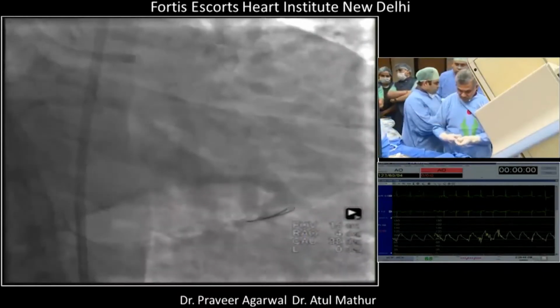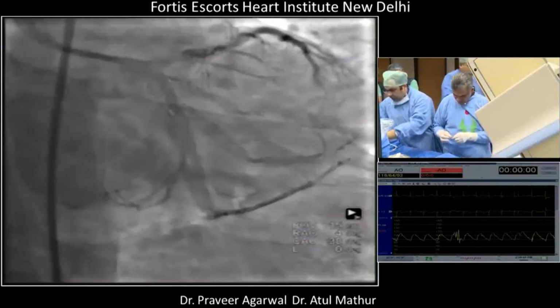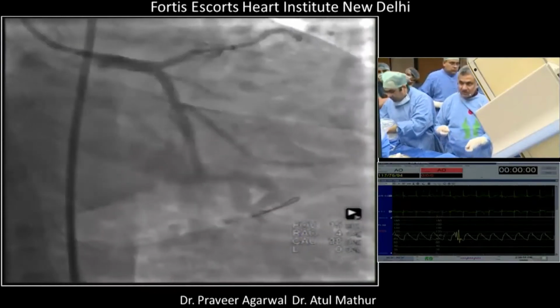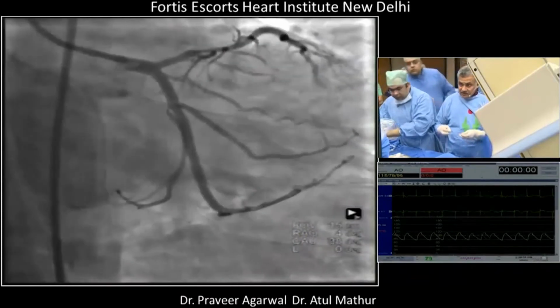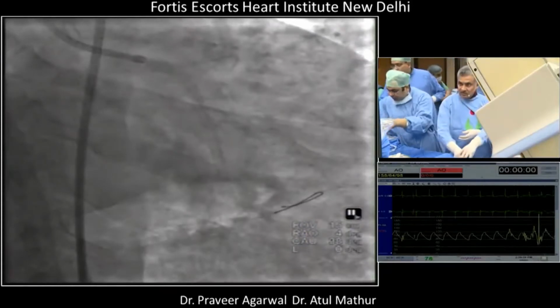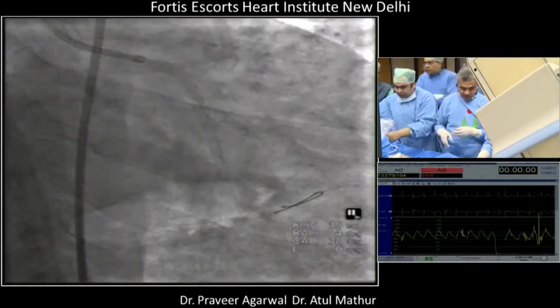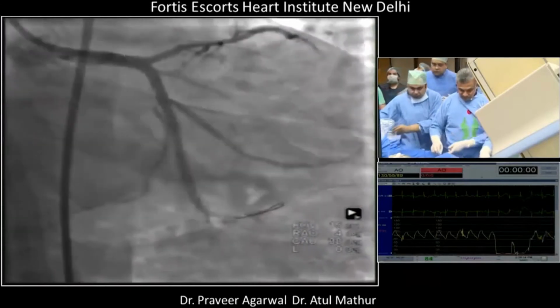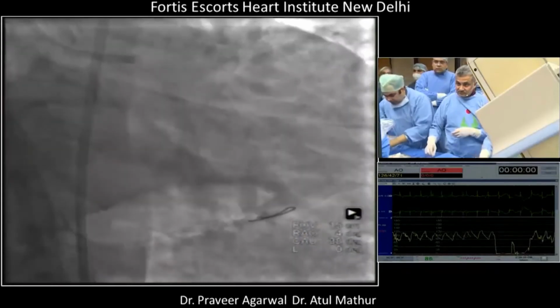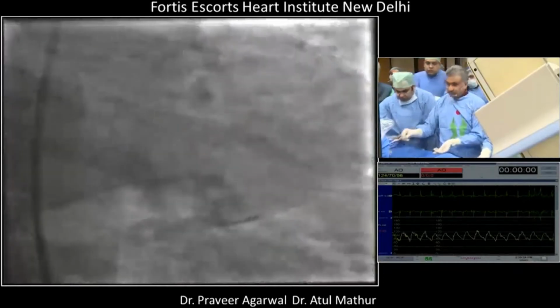Give me a fresh towel, small towel, please. Got a shape? Yep. Okay. We just have a few more minutes with you, so show us how to recross. Okay. So let's see. I know how much we can show you. But it was interesting discussing all this with you. No, this is a very interesting case.